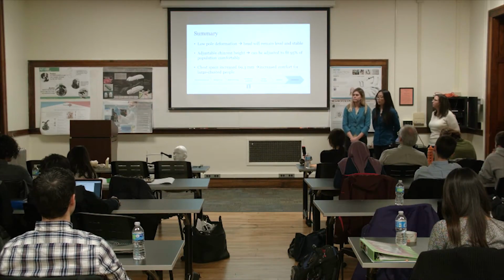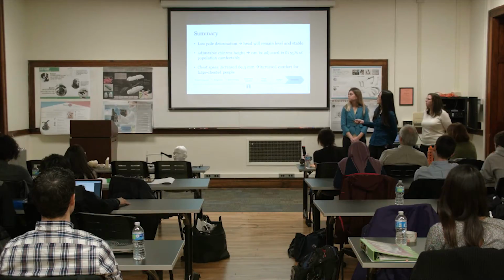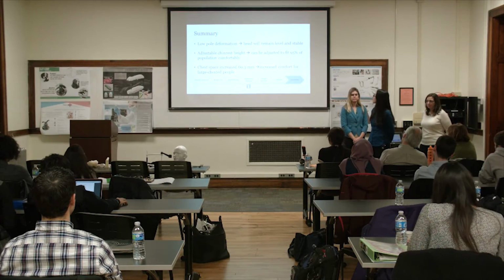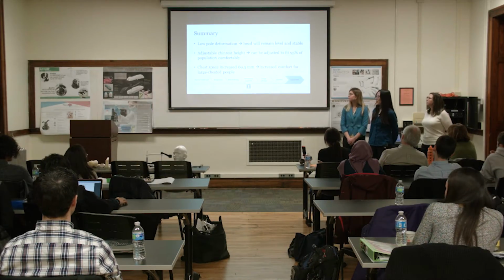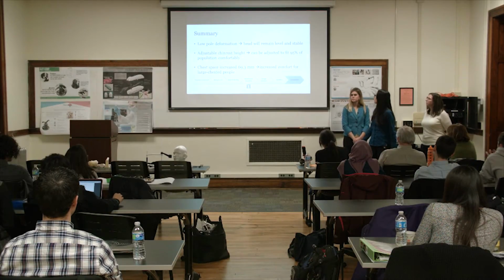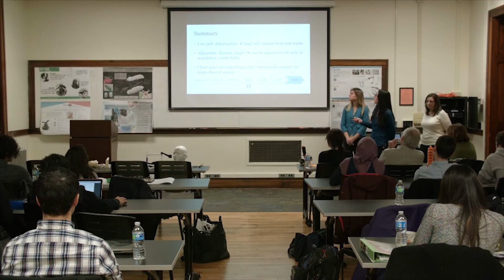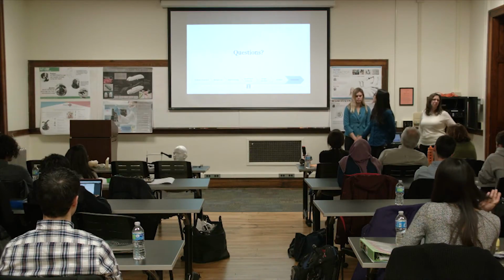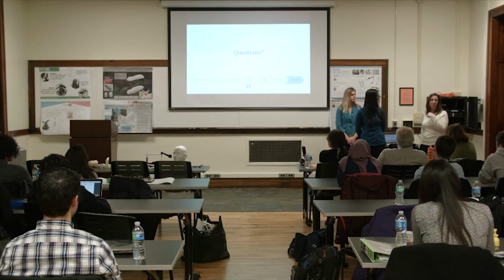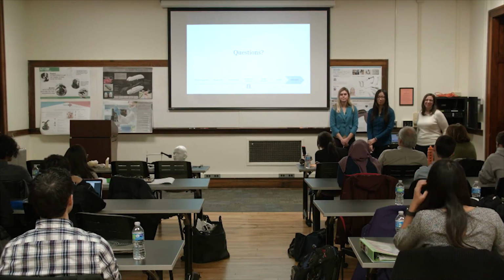So in summary, the most important part of our design is that we saved the chest space to 69.3 millimeters, so it adds more comfort for the patient, and we adjusted the chin rest height so it can move up and down for more comfort. We chose the pole material to give it low deformation, and that's pretty much it for our project. We also changed the attachment to the U-beam instead of an I-beam just for aesthetics. So it looks nicer.